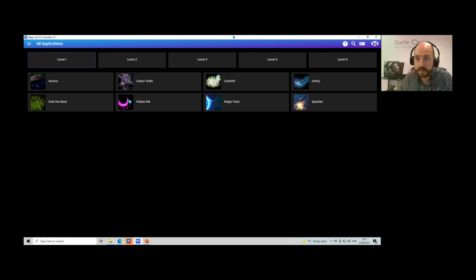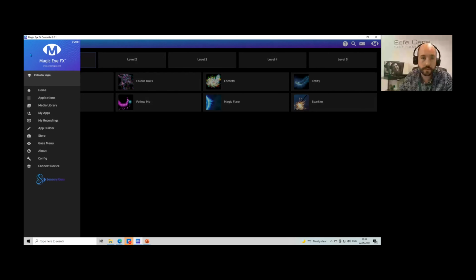And we've also got a play pause feature as well. If we want to just pause for the moment, just to take that break, so that when we look at the screen, it's not going to engage. And again, I can press the power, and that will bring me back out of the software then as well. Okay, so that is pretty much the software itself in a nutshell.